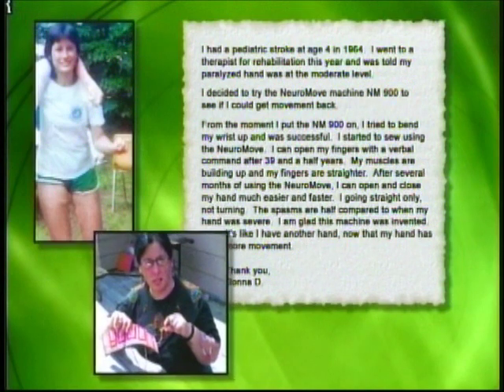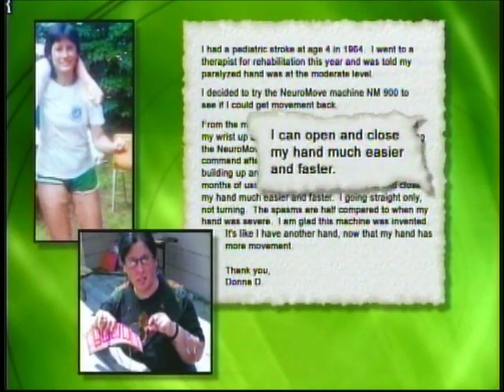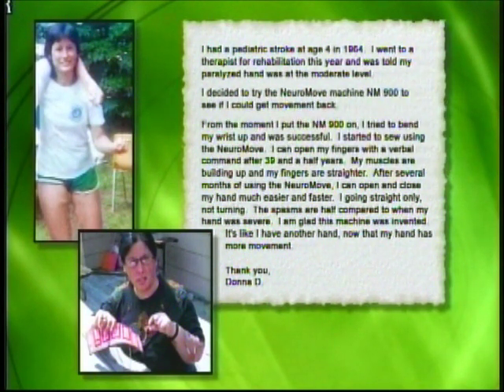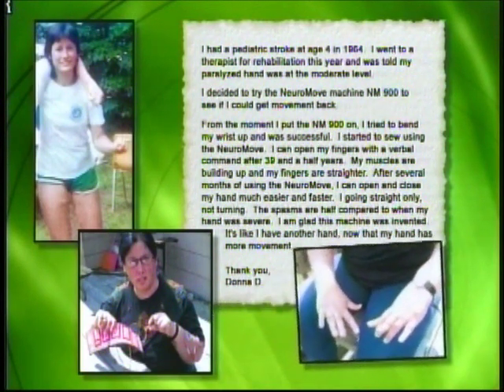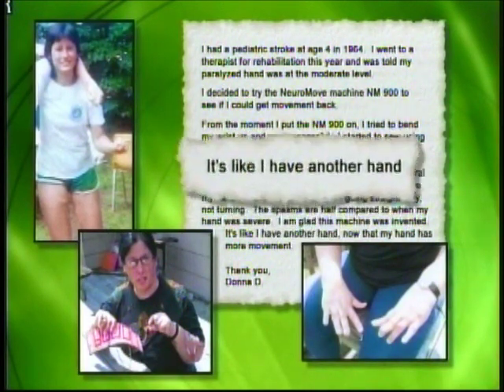My muscles are building up and my fingers are straighter. After several months of using the NeuroMove, I can open and close my hand much easier and faster. I can hold a jar in my left hand. I can put my left hand on the tractor when I cut the lawn, going straight only, not turning. The spasms are half compared to when my hand was severe. I am glad this machine was invented. It's like I have another hand.